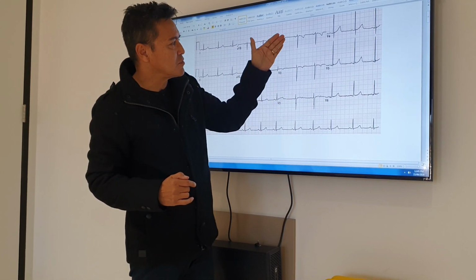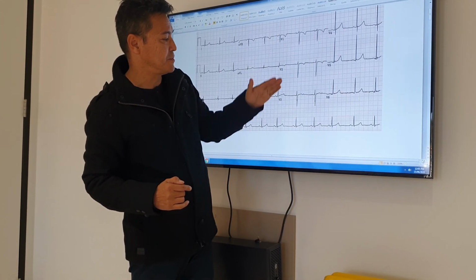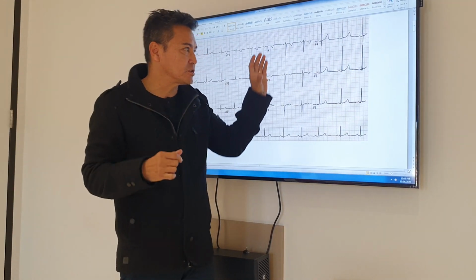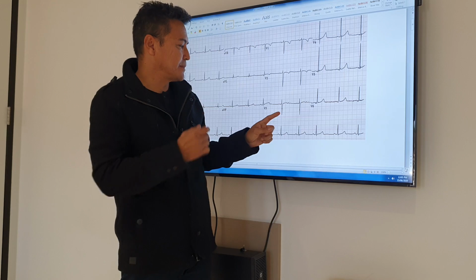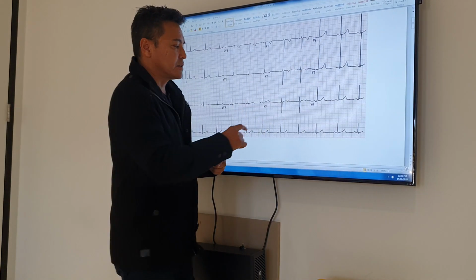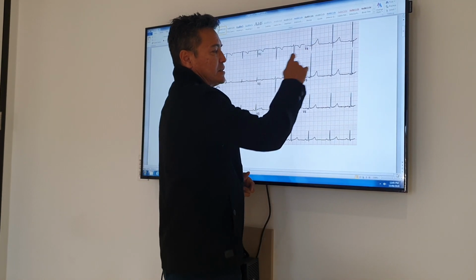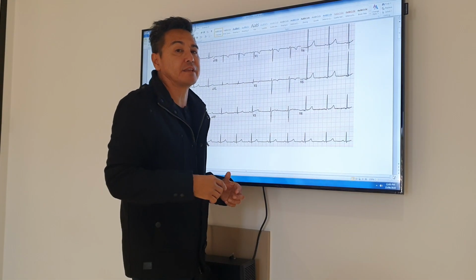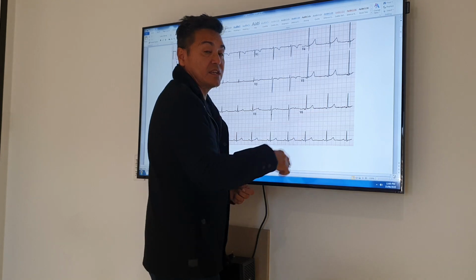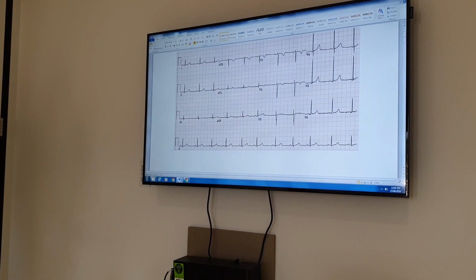And anterior leads, well, there could be some anterior lead sort of involvement here, which means that there's an anteroseptal kind of suspicion that's going on. So that's V3 and V4, sorry. Okay, so V3 and V4, but look, having a look at the anterior leads, the anterior leads are quite normal here. So I don't think there's a suspicion of the anterior leads at all, maybe the septal leads. But then we look at 5 and 6, that's normal too. So let me show you, stay on there, I'll show you an abnormal ECG.